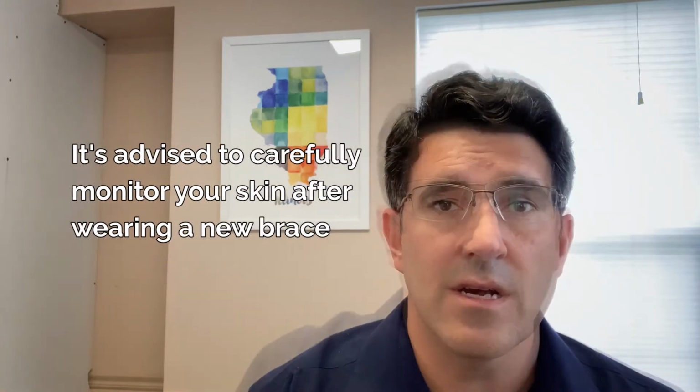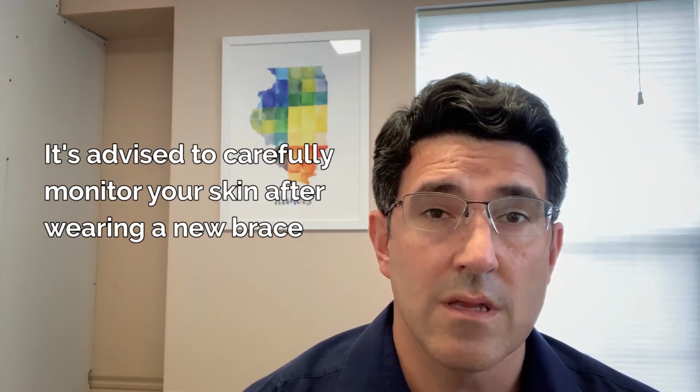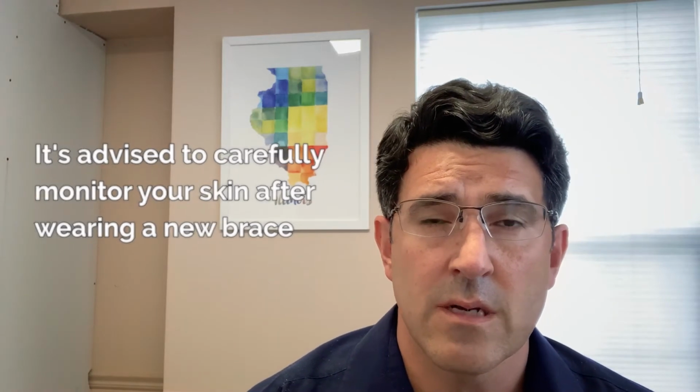So monitoring your skin, and especially doing that with your eyes, especially as soon as you get a new brace, checking the skin maybe more frequently than you would later is a good idea. Sometimes we tell patients even, hey, within the first 15-20 minutes after you leave our office, please check the skin just to make sure there's no issues. That way you're kind of safe and your eyes can tell you how your skin's doing. Just remember though, a mild discoloration that goes away quickly isn't usually a problem.